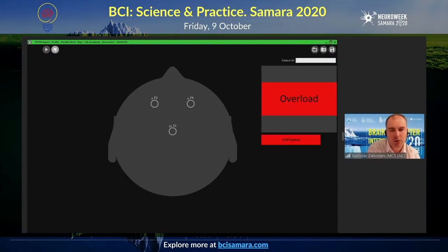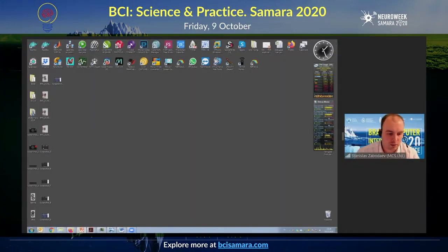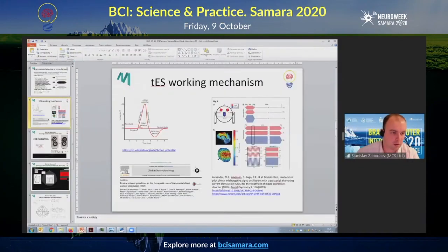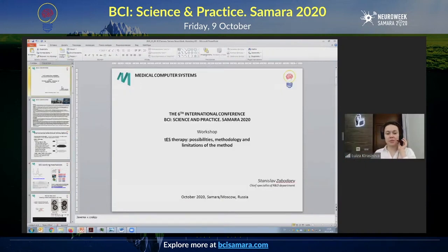I took off CZ electrode. If it was not well connected, you will see that alarm. I basically ran out of time. It's 5 minutes left until the end of the workshop. I don't want to hold on too much of your time, and I will be ready to take your questions.